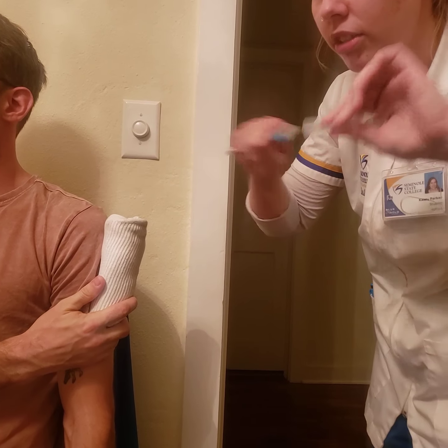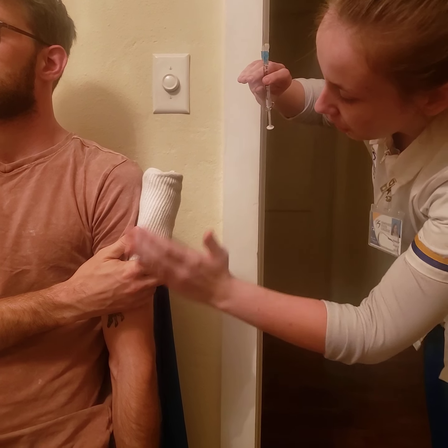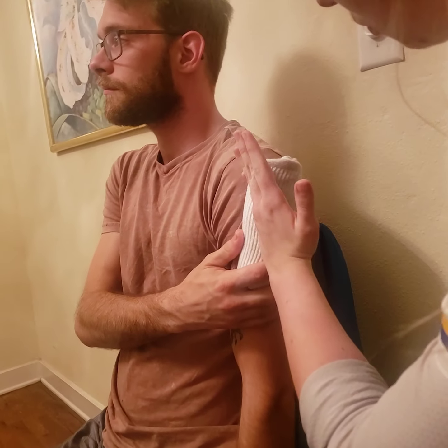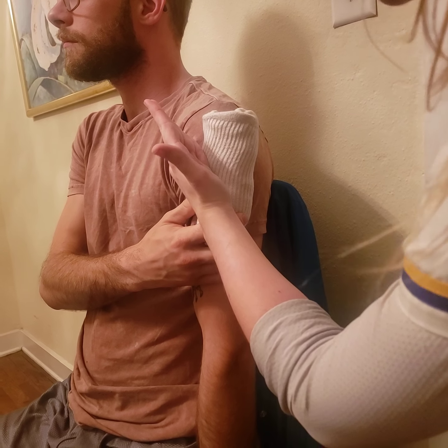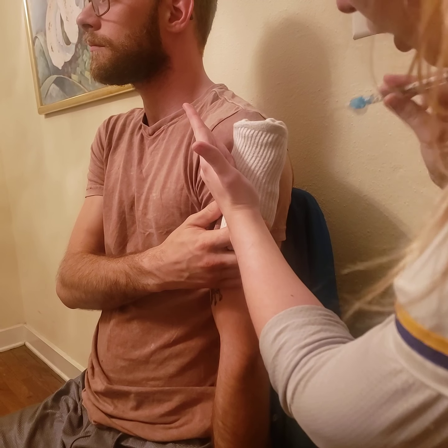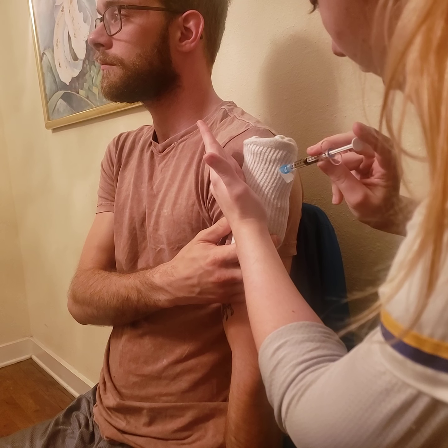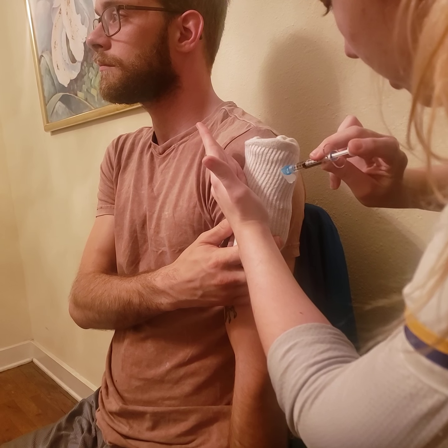Alright, Miss Anna. So I'm gonna go ahead and do my Z-track with my non-dominant hand. I'm gonna take this and move it over laterally about 1 to 2 inches, and I'm gonna go in like a dart at 90 degrees. Okay, and we're gonna go slowly inject.